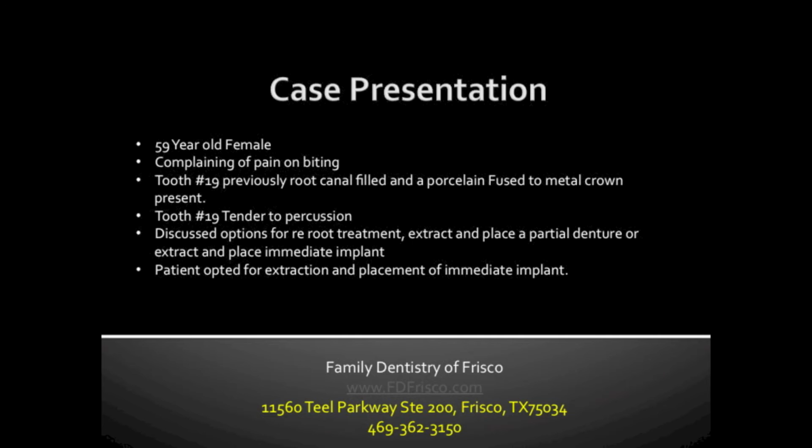Here the case presentation, we have a 59-year-old female who lost a tooth due to a cracked tooth. The tooth had been previously root canal filled approximately 10 to 12 years ago, and she had come in with pain from that tooth. When we examined the tooth, we found that it did have signs of being cracked, and there was pain on biting.